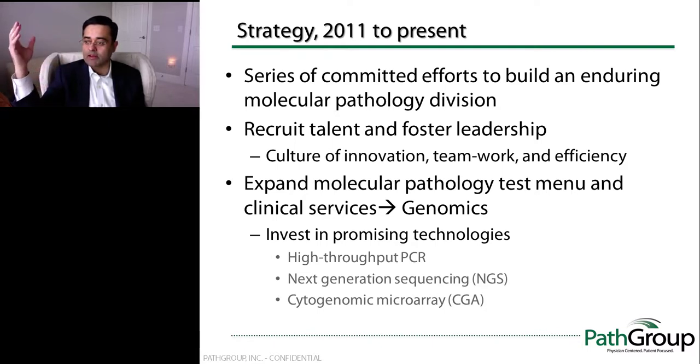There are PCR-based as well as what's known as hybrid capture-based technologies that allow for next generation sequencing testing on a variety of platforms that are available commercially today.